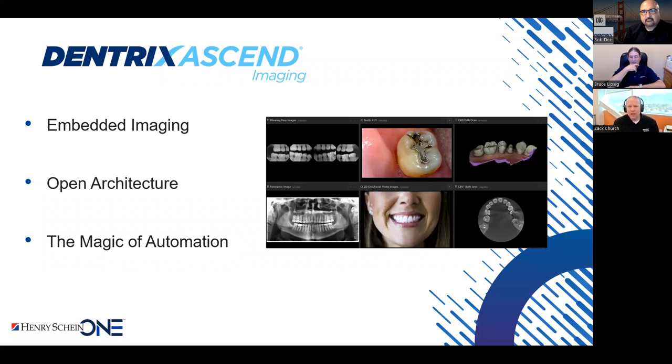I mean, multiple people, and they're not the team that spends time developing schedule features or reporting features. They are dedicated to imaging. And as you'll see, there are a lot of very advanced imaging tools and imaging technology that Bruce will talk about that you really just won't get elsewhere.